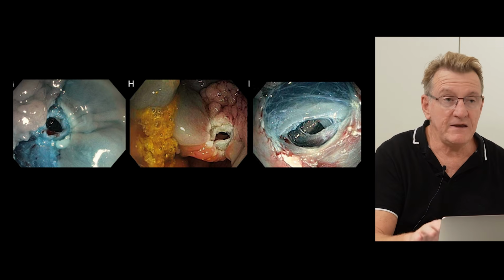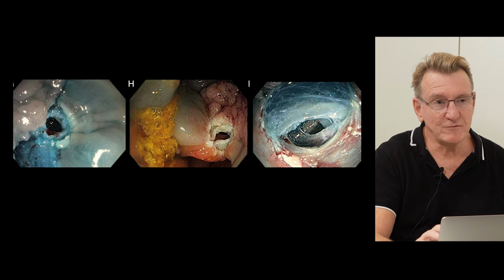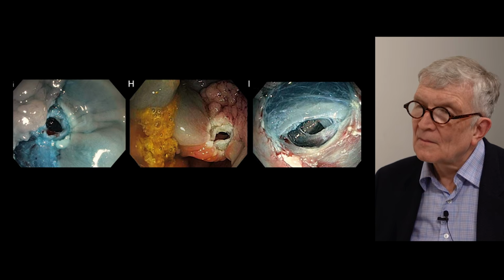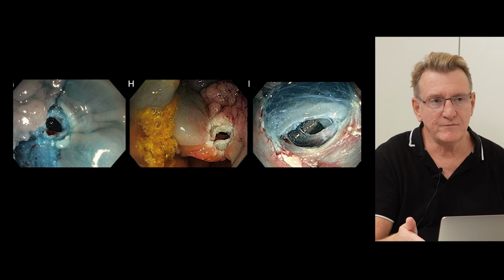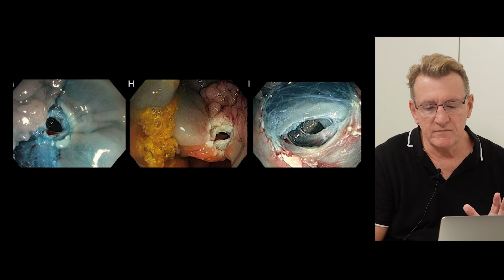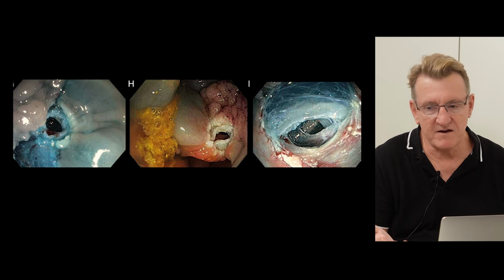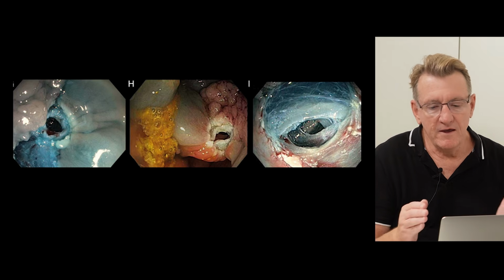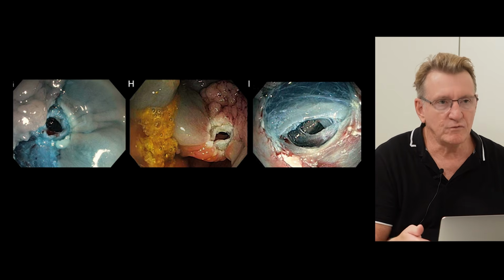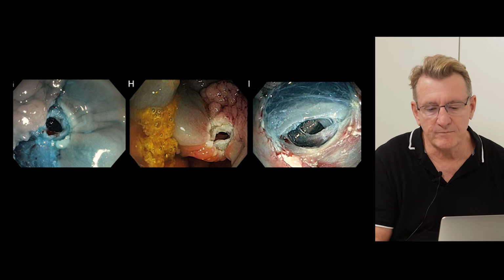In the era of air, this is a disaster because the patient would very quickly get a tension situation within a minute or two, a couple of minutes. But in the era of CO2, it's not a major problem, provided in the stomach we sometimes have holes that stay open for half an hour, 40 minutes, doesn't matter. But in the colon, of course, you want to close it because there's a risk of contamination, so you close it up pretty much straight away.